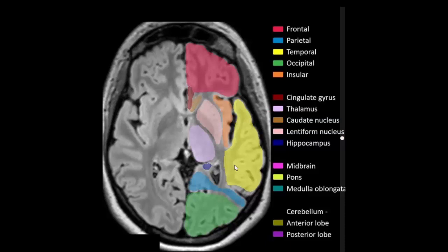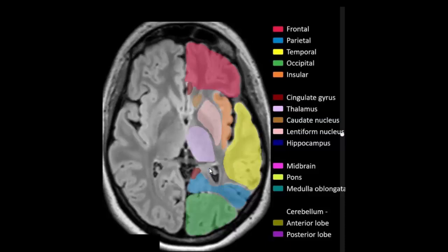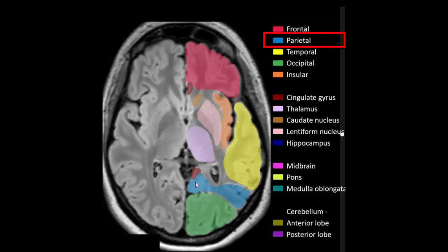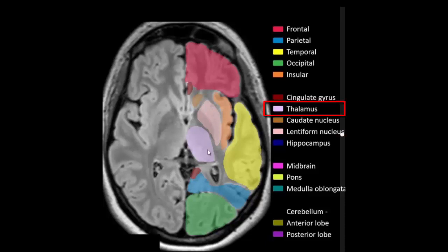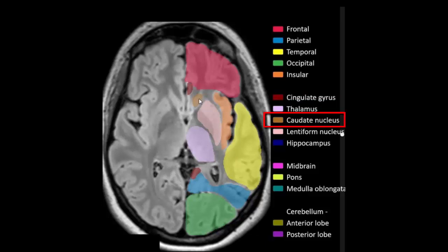Frontal lobe, temporal lobe, parietal lobe, occipital lobe, insular cortex, lentiform nucleus, thalamus, cingulate gyrus, head of caudate nucleus.